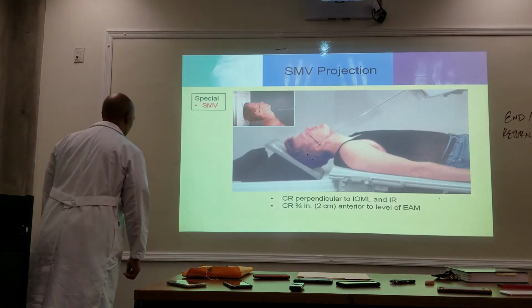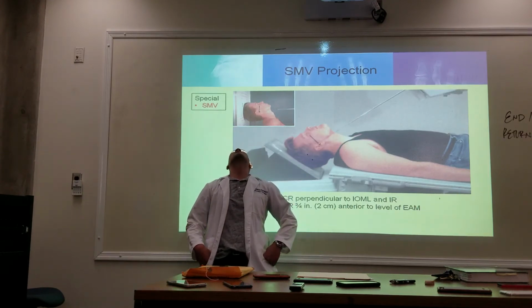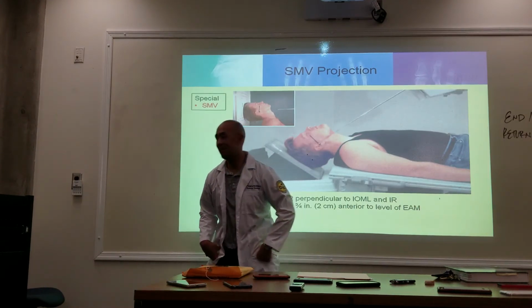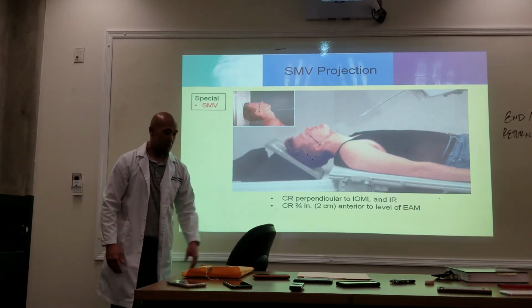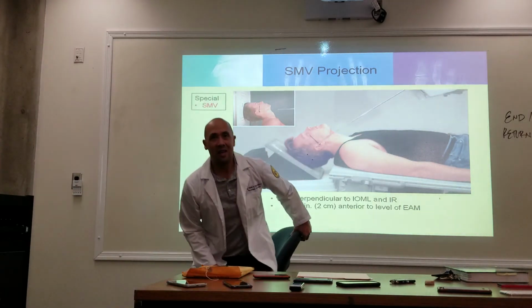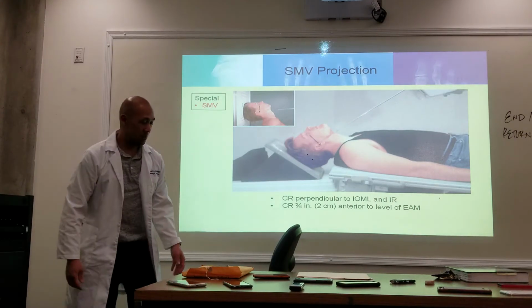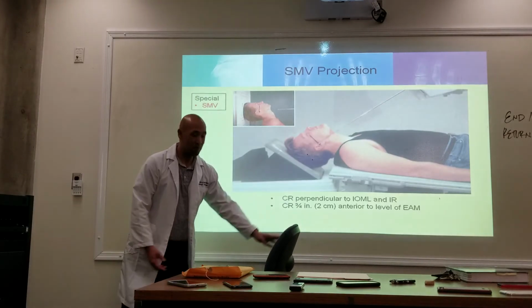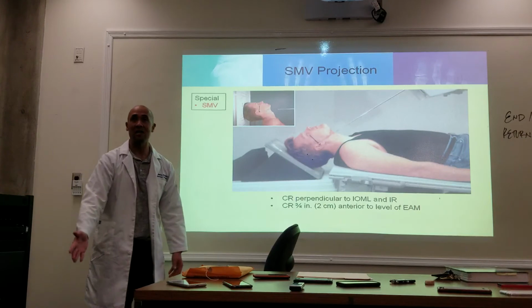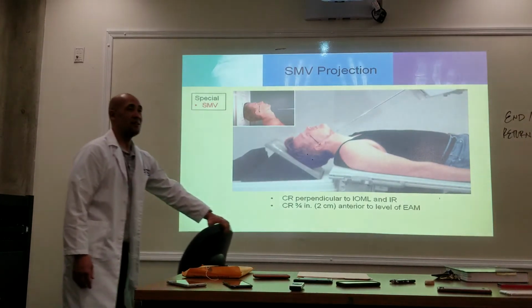So to accomplish that, you're not going to be able to have them stand and do this. Or could you? I think I could. But you would get a chair and have them sit on it and tilt their head back. But the chair you use can't have any wheels. Yeah, it can't have any wheels, because if you're leaning back and the chair slides from underneath you, now you'll be doing more than just a skull. Okay? Good for practice.